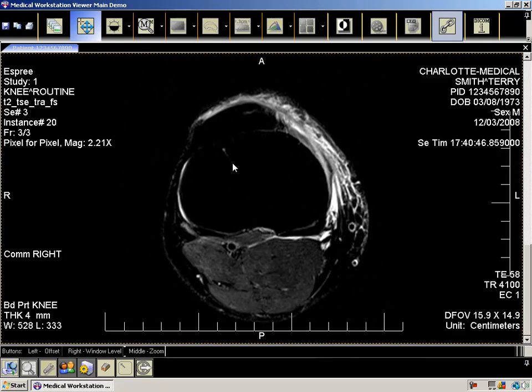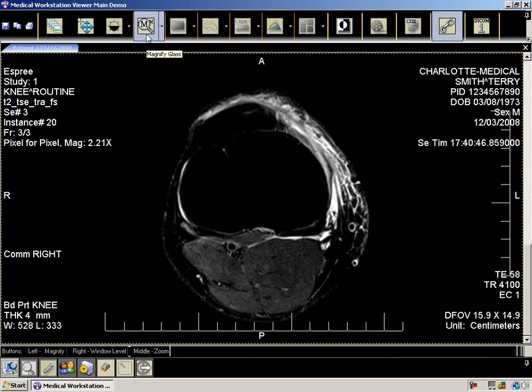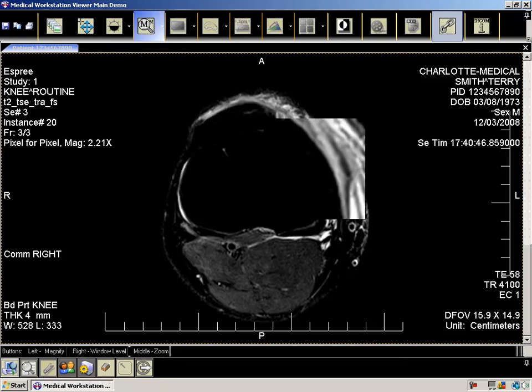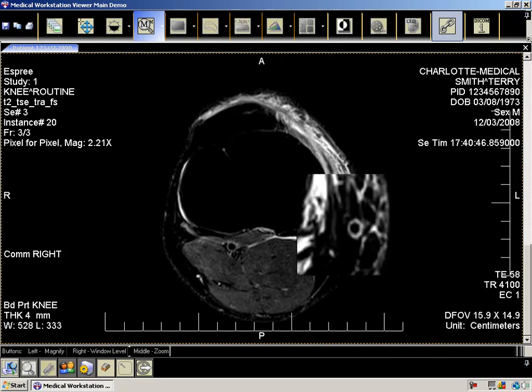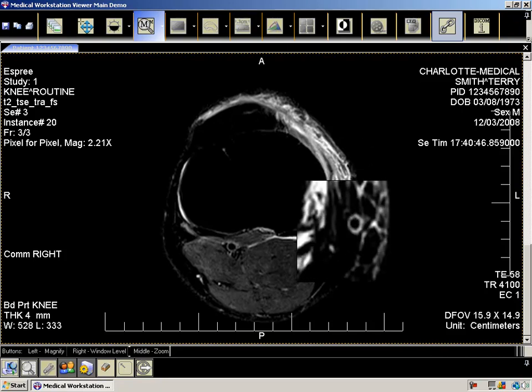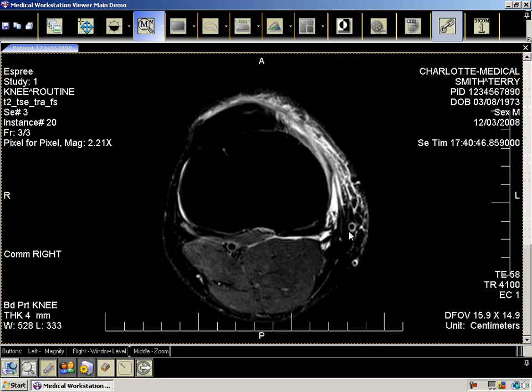Next, we put all the zooming features in one button. Left-click on the magnifying glass button to enable the magnifying glass and note the updated status bar. Click on the drop-down to modify the zoom level of the image in the viewer.